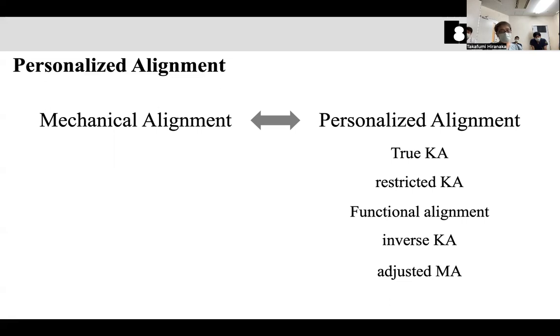Once we allow minor varus alignment, soft tissue release will decrease dramatically. So the most serious concern about mechanical alignment is medial side tightness. Most patients have a constitutional varus. So in such patients, to correct the leg alignment to be neutral, medial MCL release is mandatory.